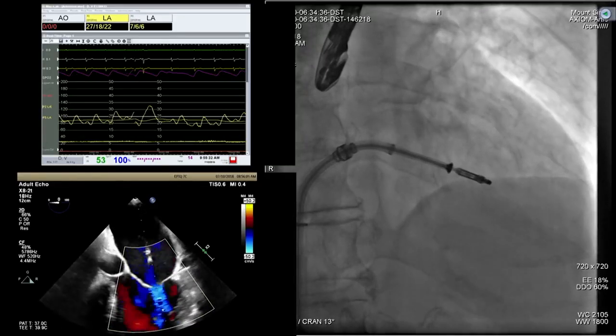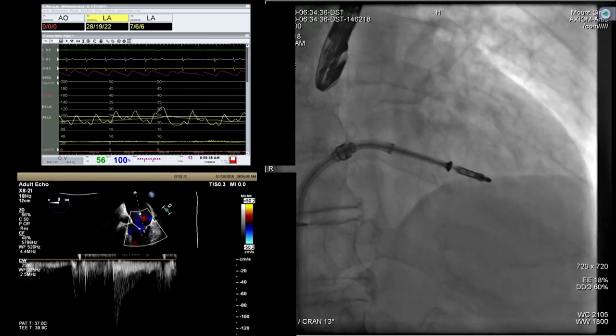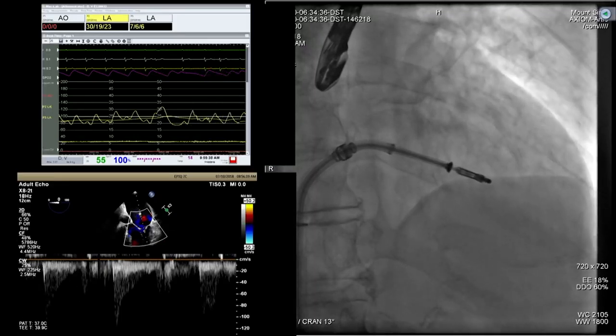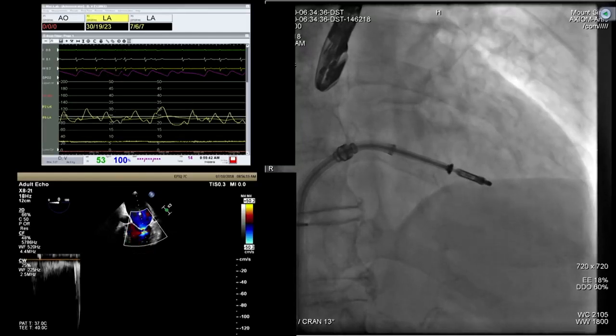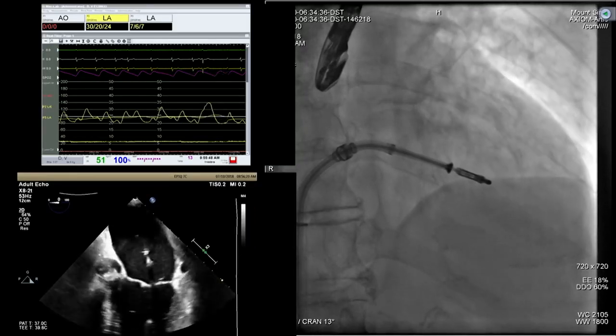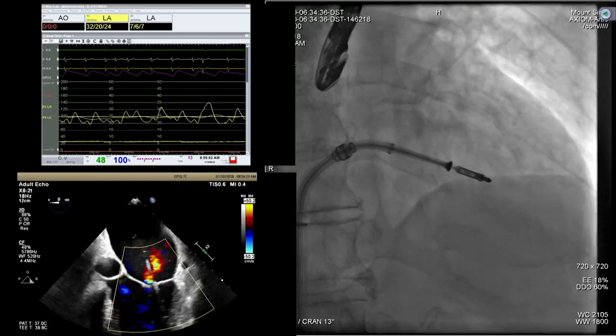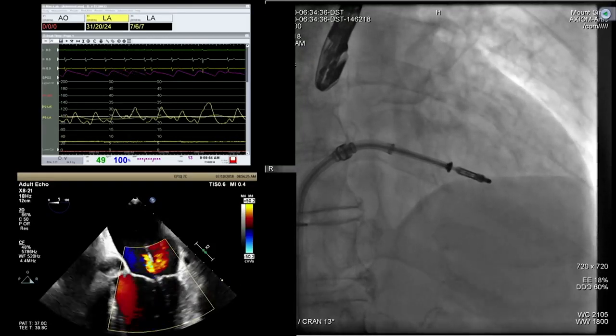I think now that you have your reduction of the V-wave, you have a very small gradient. The only thing to check is the insertion. So I think you're very good here. Gradient is only one. We'll see, you can get more. This will be the first case we use 2 XTR in one case. You want to be the first one? I'm sure everybody has done it. No. Okay. I think we should. We can do it offline if you want. We'll do it offline.